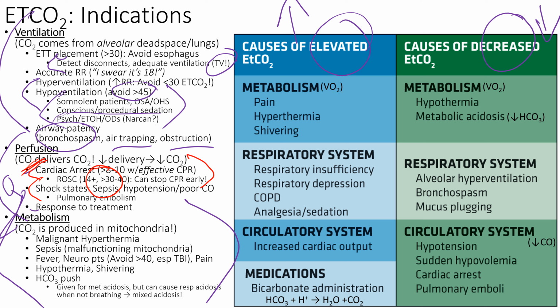Okay, so we can look for a response to treatment. I gave pressors and their end tidal CO2 went up. It's like, well, that makes sense. I can see my MAP right there. It's improving. Okay, and then some of the weird stuff.